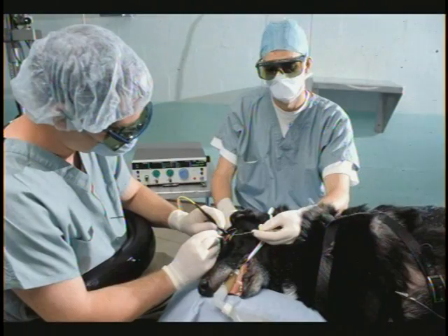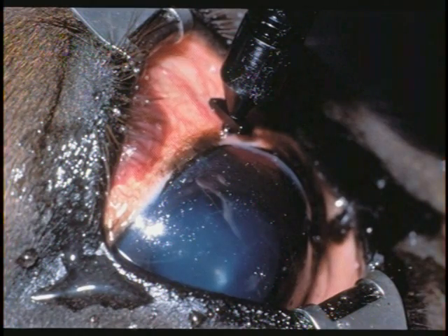In addition, animals with medically or surgically controlled glaucoma require sequential determination of IOP to ensure adequate control, and animals with unilateral primary glaucoma and breeds predisposed to primary glaucoma require monitoring of the IOP in the unaffected at-risk eyes.